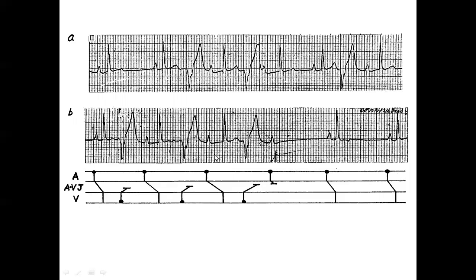This patient has frequent PVCs. Among the conducted sinus beats, PR short, PR long, PR longer, then P block. Very interesting situation. The patient has a ventricular bigeminy, and among the sinus beats, they have a Wenckebach phenomenon. What's causing it? Well, the PVC conducts retrogradely, penetrating into the AV junction, disturbing the AV junctional tissue so that the next impulse will take a longer time.